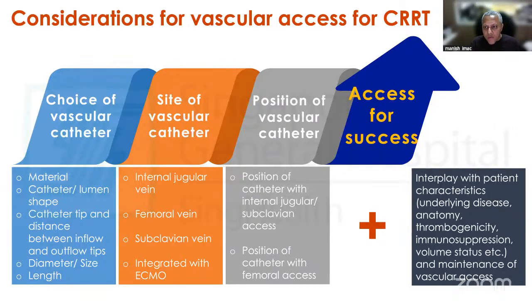compartment. And therefore, it is very, very important that you take your time and make your assessments and get a good, proper vascular access. Because if you do not have a good access, no matter how good and precise your prescription, how good your anticoagulation strategy, it is very likely that you will run into problems of performing a proper CRRT, and you will be troubled with multiple interruptions and alarms.